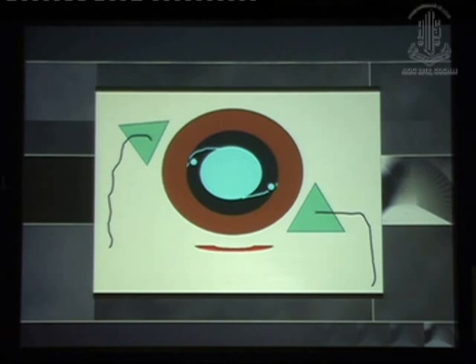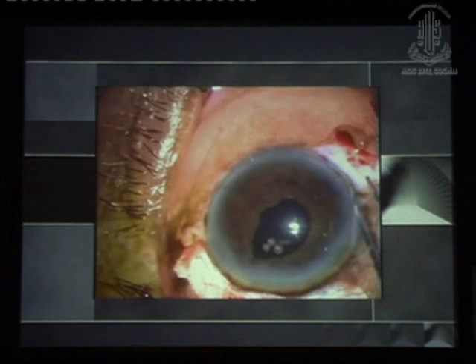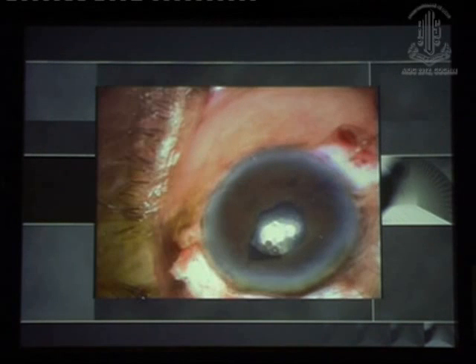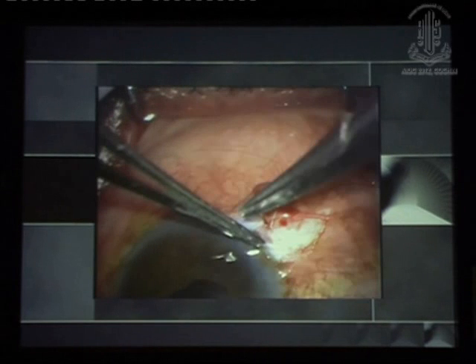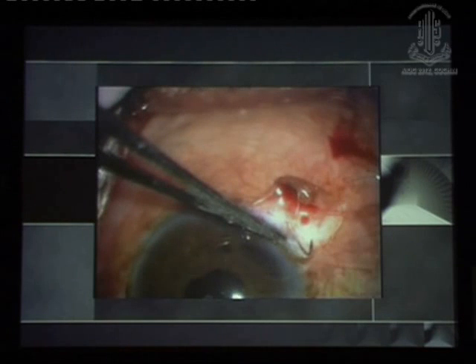This is just to show the suturing technique. Dr. S.K. Rao is going to deal with it in the next topic. At the end of the procedure, you close the conjunctiva either with sutures or with glue, remove all the viscoelastic substance, and give subconjunctival triamcinolone or dexamethasone.